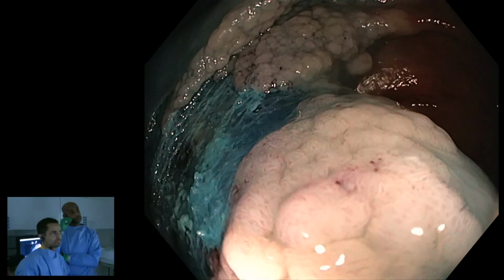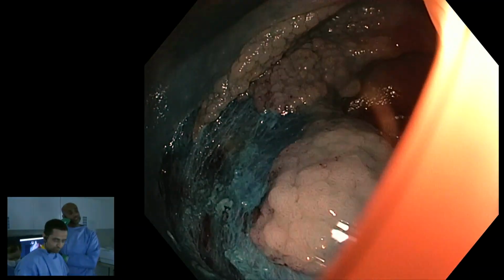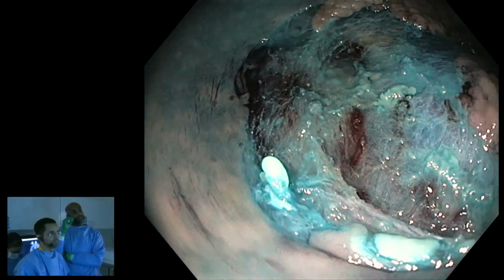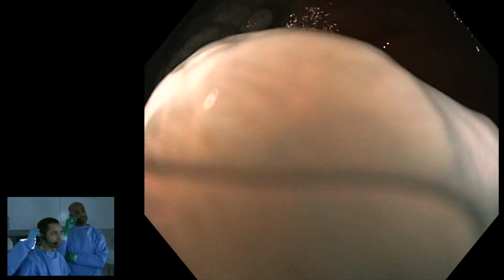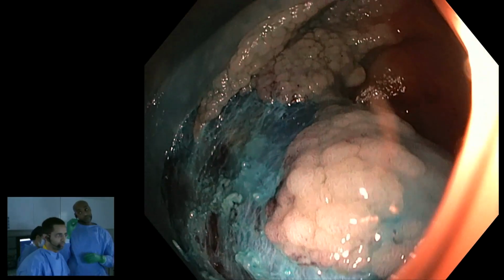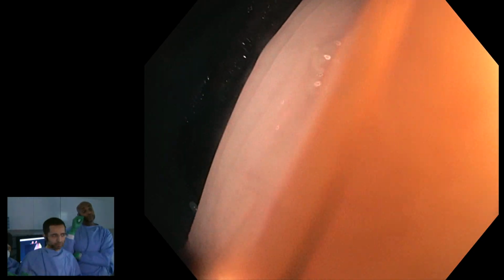So Majid did a very good job. He started with a submucosal injection, using saline with methylene blue and diluted epinephrine, 1 in 100,000. He started from one edge and took the resection piecemeal with good margins of normal tissue. So Majid, I think we'll do some more resection now. As Dr. Majid nicely demonstrated, no cap, it's a no cap day. Normally, I would like to have a cap in this situation.